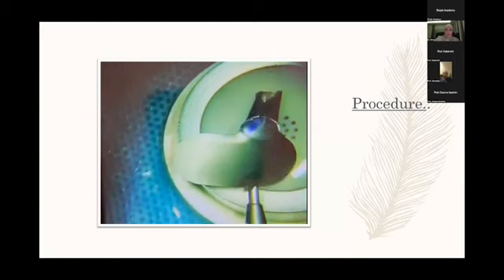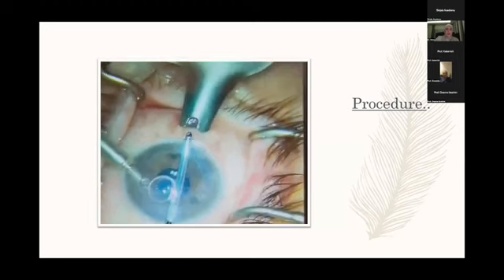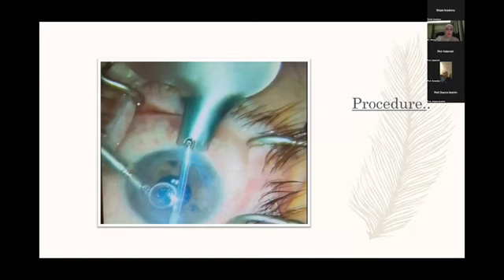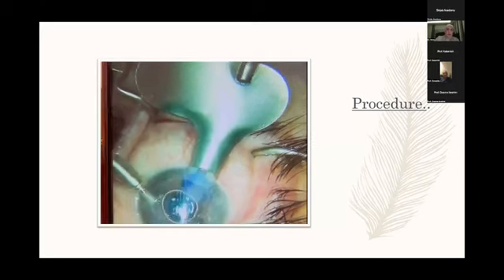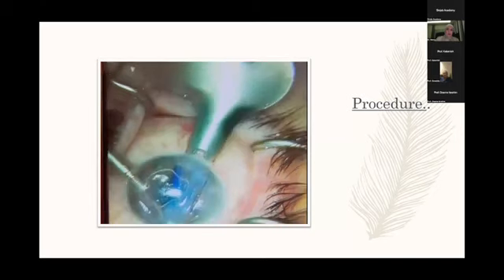And then it's very important that I make sure that the forceps comes out smoothly from the wound, from the side, before I start pulling it. Now, I always say it's very important not to let go of it, because sometimes the cornea flips, sometimes things happen inadvertently. So I just keep holding it until it is inside the AC.